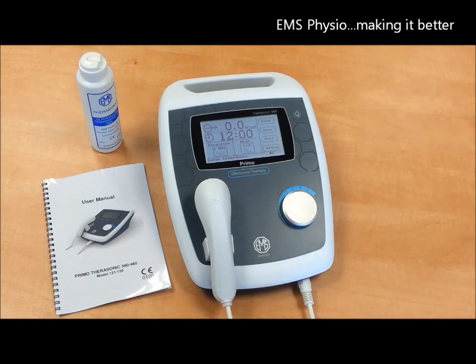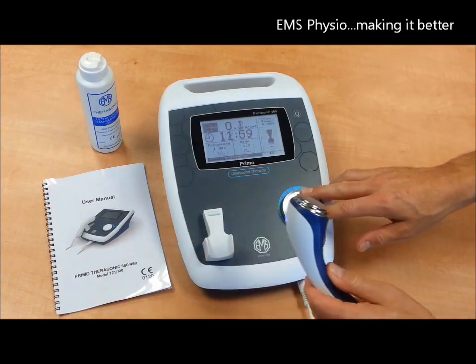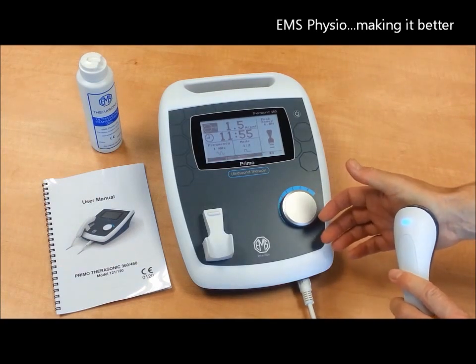And now you are ready to start treatment. Simply turn the dial to the desired output once the treatment head is placed at the site of the injury.